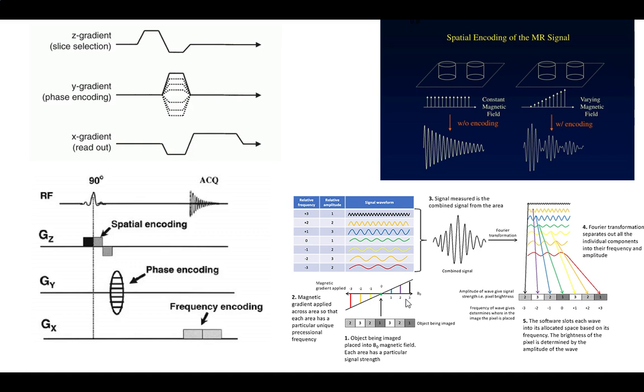Right. And we just draw it simply, but when you turn it on and turn it off, we don't worry about the turn on one because you're not doing anything. Nobody's reading it. But when I turn it off, things are oscillating and I don't want to screw with that. So I just have to turn it off in a way that minimizes the effects on the signal. That's all that's trying to show. And sometimes people don't even show it, but I like the ones that do.